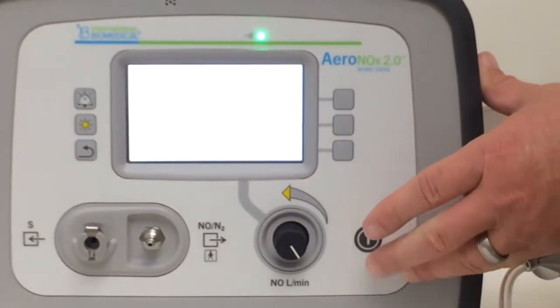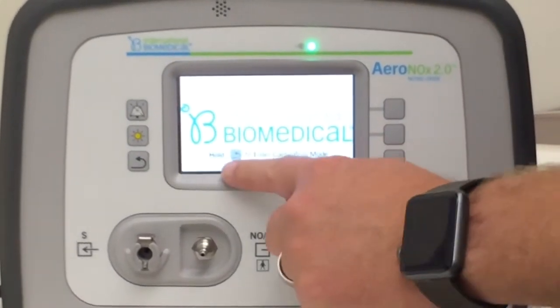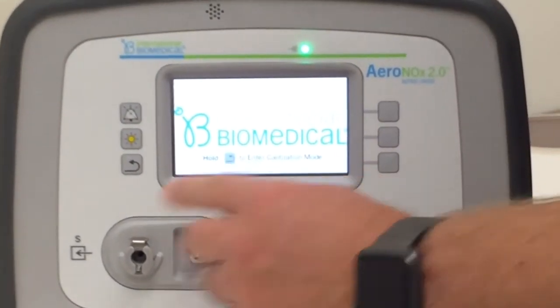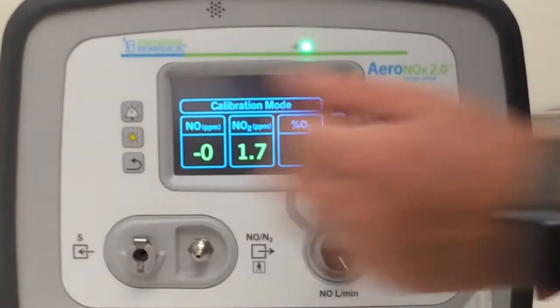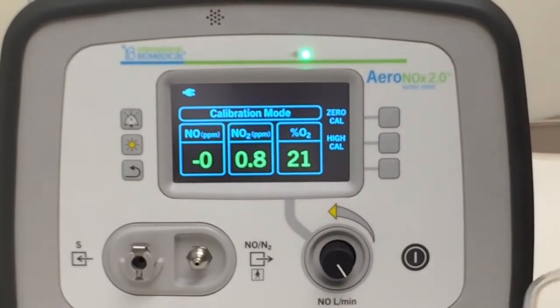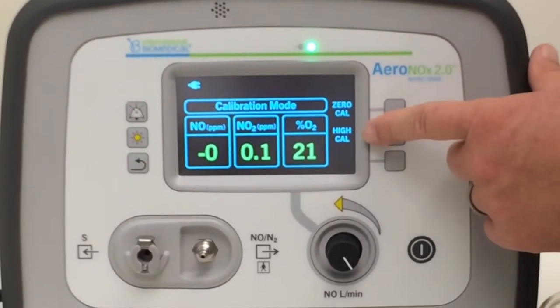When you first turn the unit on, you're going to see this little reverse button here — hit that to enter calibration mode. Now you're in calibration mode. You've got some options: zero CAL and high CAL.